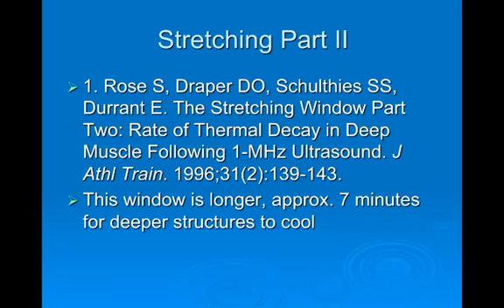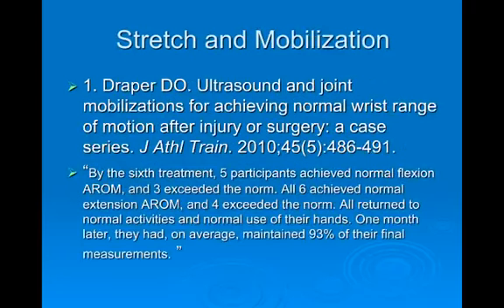But something definitely to keep in mind, if you're doing an ultrasound, plan on doing a joint mobilization or doing some stretching, you've got to be on it. You can't let it sit and then go and expect that you're going to have any effect from your ultrasound. Okay, so these are critical issues when it comes to whether we are going to have an effect with our ultrasound or not, that you need to be aware of and on top of.